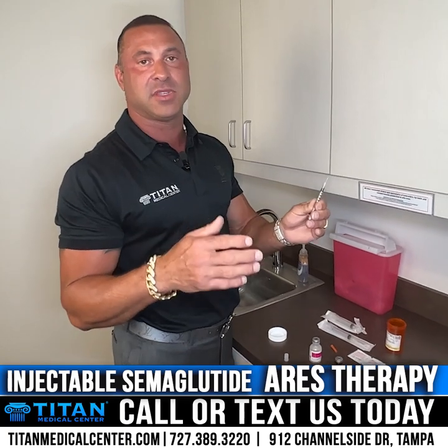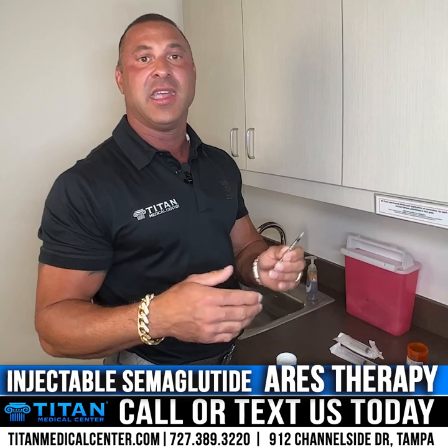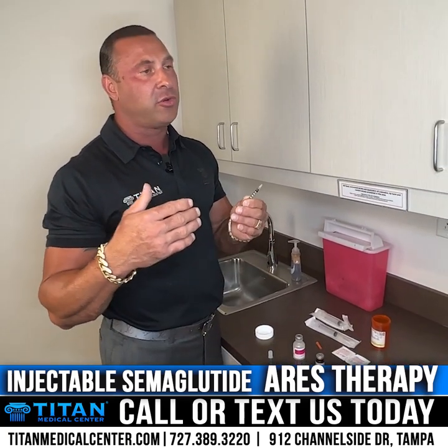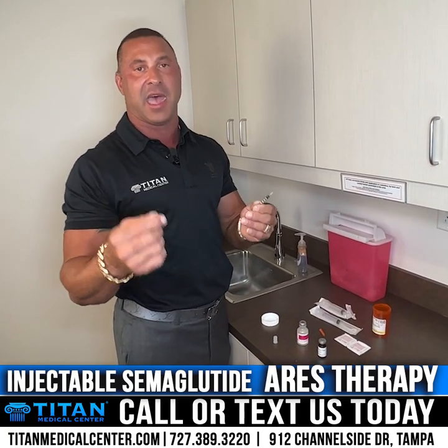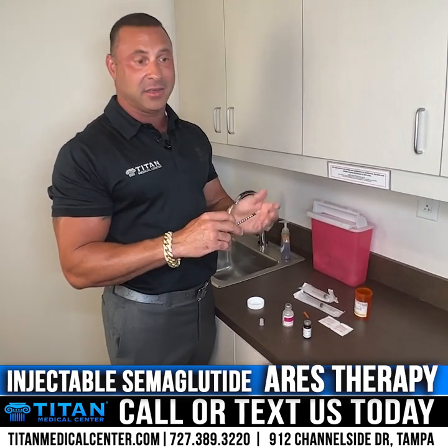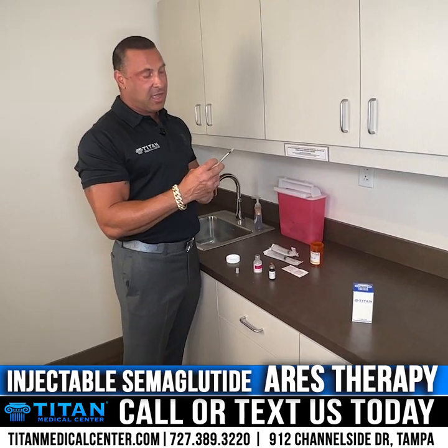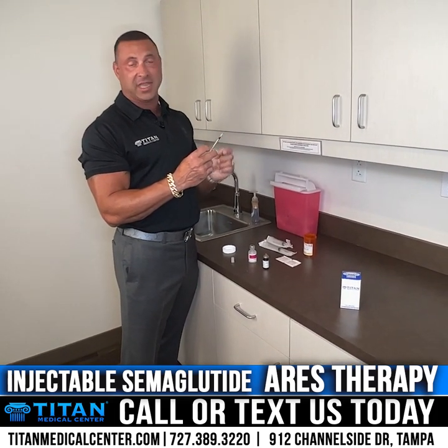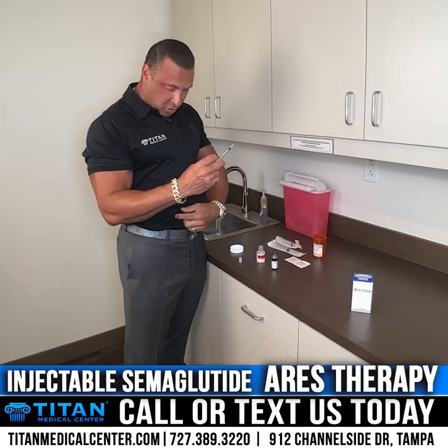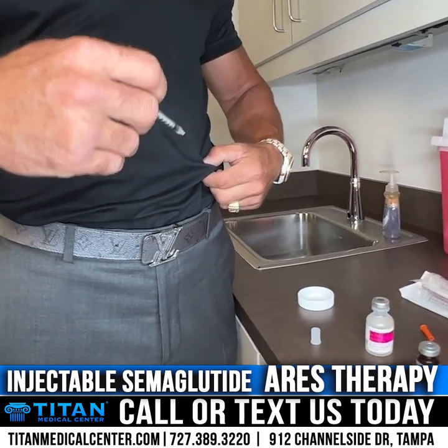If you're having any negative symptoms or questions or concerns, contact us directly at 727-389-3220 and our medical staff and providers will walk you through any issues. Your first dose is injected subcutaneously — that means right in the abdomen, three to six inches from your navel on either side, at a 45-degree angle going in across the stomach.